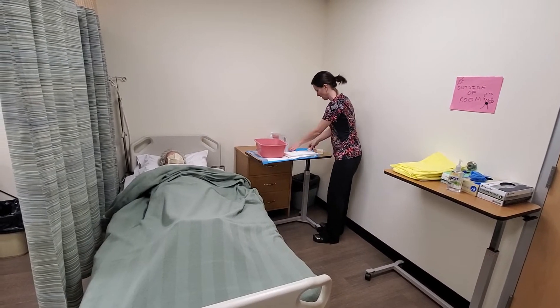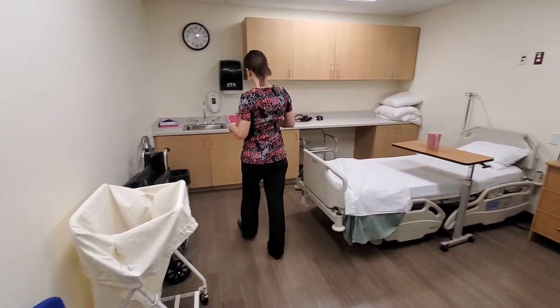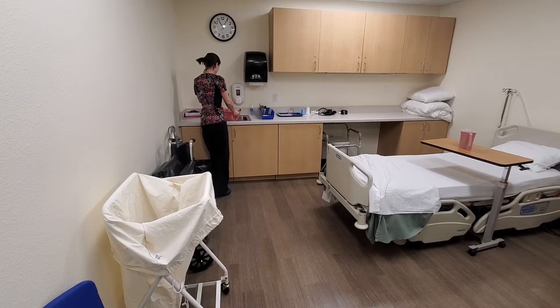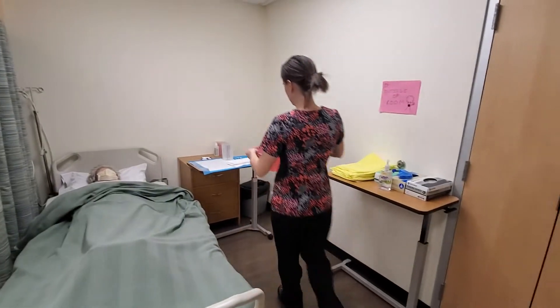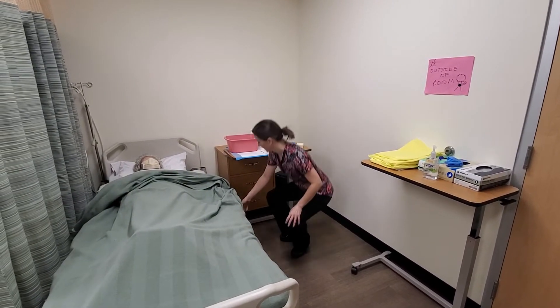I'm going to fill the wash basin up with some comfortably warm water, then lift the bed up to a comfortable working height.